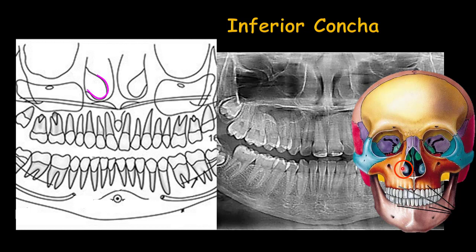The concha is covered with mucosa, and underneath the concha is a space called the inferior concha meatus. You can see this in the schematic view and in the panoramic radiograph.